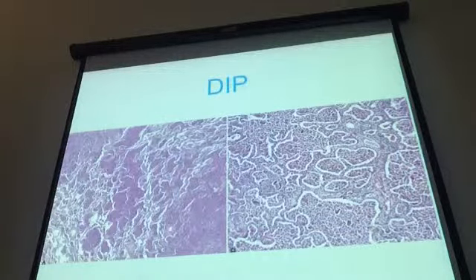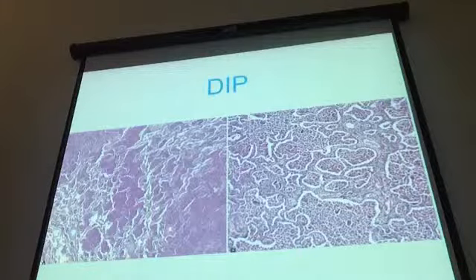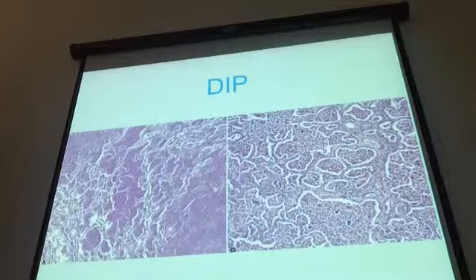So what pattern is this? There's a lot of macrophages, and they are where? Inside what space? In the alveolus. So this is the alveolar filling pattern that we talked about. And this is the main thing on the differential for that, but other things, pneumonias and so forth, could also have this low power pattern. This is just one of the differential considerations.